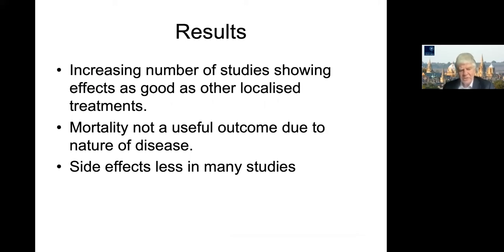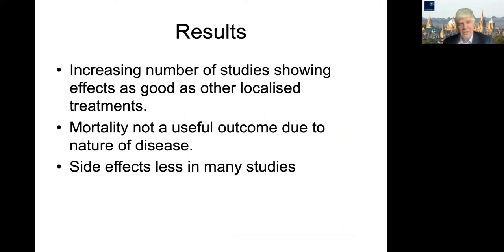And I think that if one's able to improve the HIFU treatment for prostate cancer, it just could have a major, major impact in the surgical treatment of prostate cancer in the world. So I think at the moment, as far as surgery goes, you need to treat about 30 patients to save one person's life, and you get quite a lot of morbidity in terms of incontinence and erectile dysfunction. So a good HIFU treatment of prostate cancer, I think, could revolutionize the treatment of prostate cancer around the world.